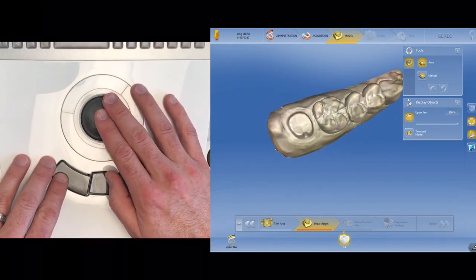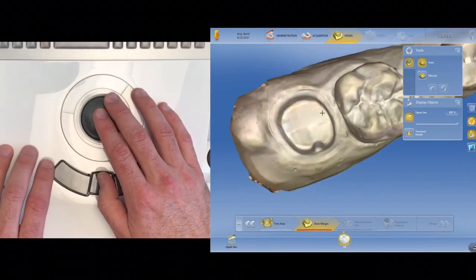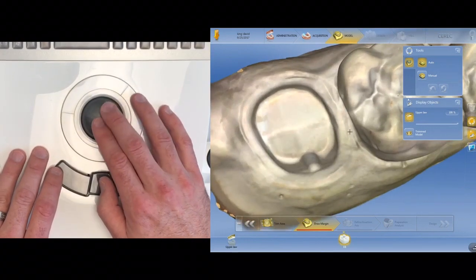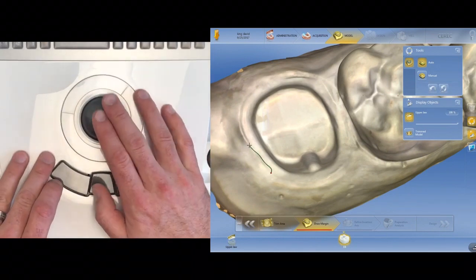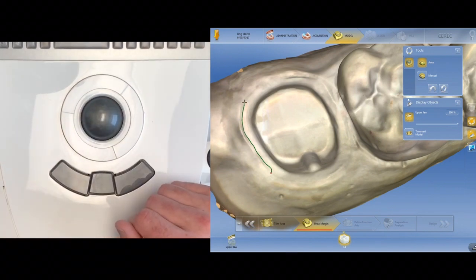All right. So for marginating, remember like we talked about in the last video, you always want to be outside. If you're ever in doubt, always be a little bit outside of the margin. This is difficult to differentiate because this is a model and it's all the same color, so I'm just going to do my best. Double left click to start. You can see the machine is kind of finding that margin. I'm going to put it on manual margin mode.